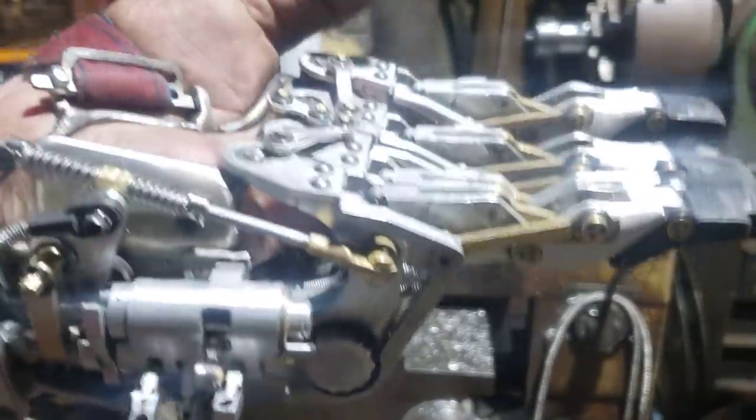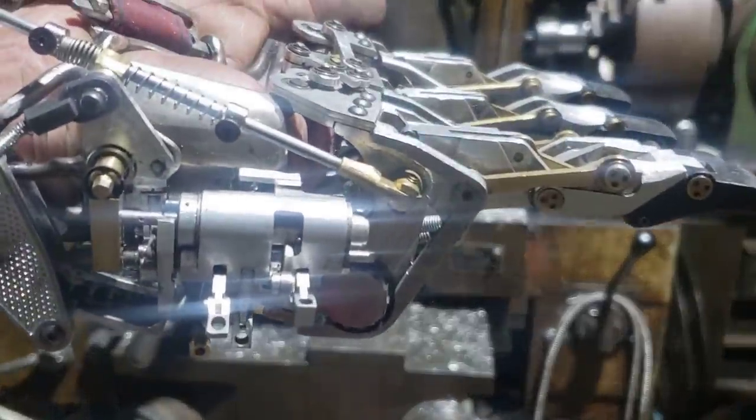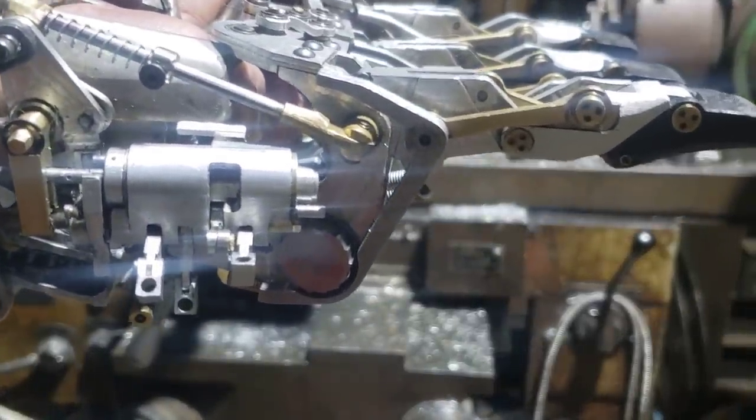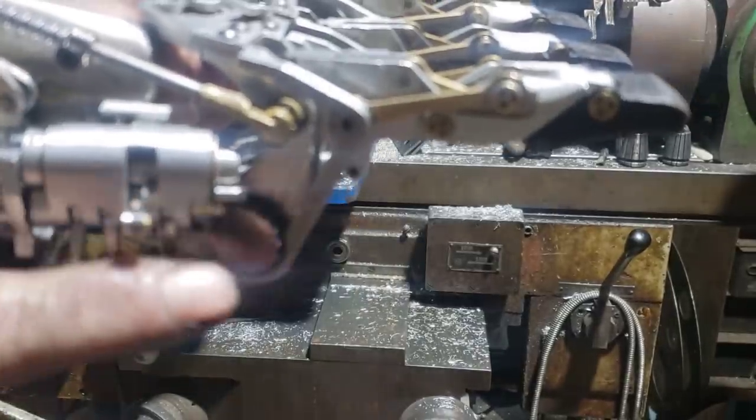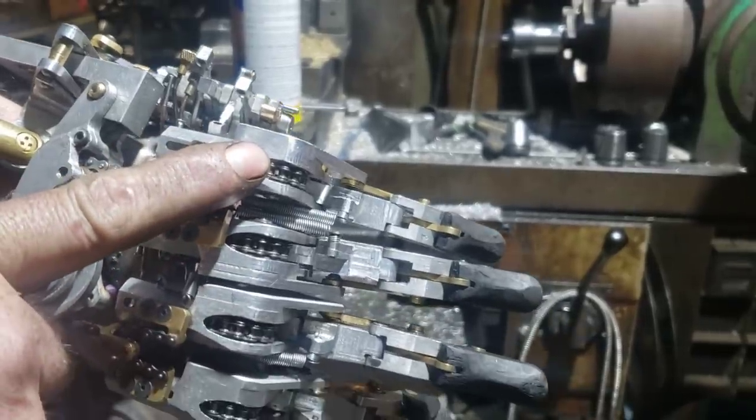But this one includes a mechanical grip pattern selector that, with the over-travel of the lateral motion, cycles through six different grip patterns on this cam, which then holds and operates these rocker arms to open and close the sprag gears.